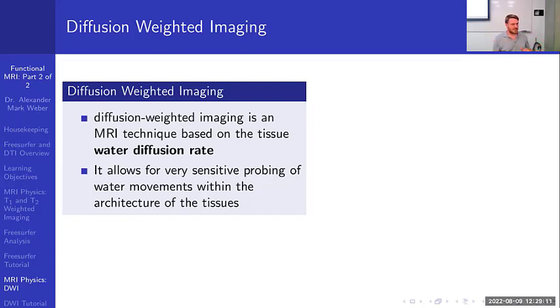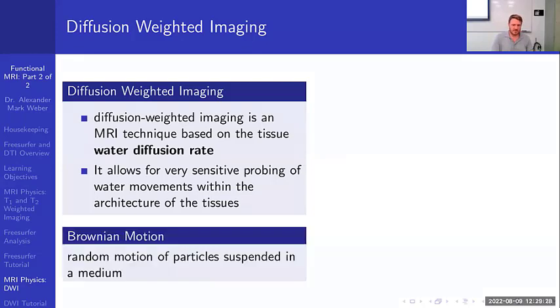Most people are interested in white matter and white matter tracts, but there are now various ways to analyze DTI data that can give you interesting information about both CSF and gray matter brain cells.